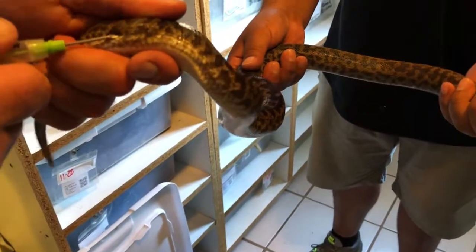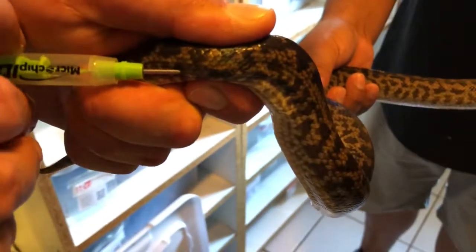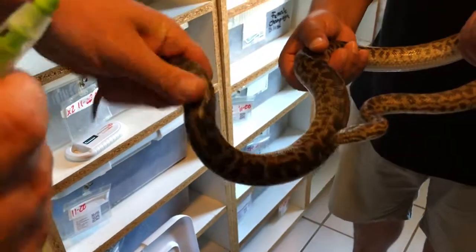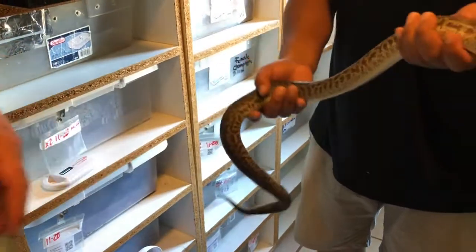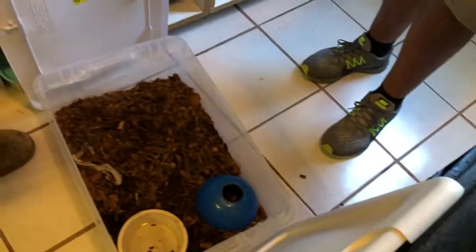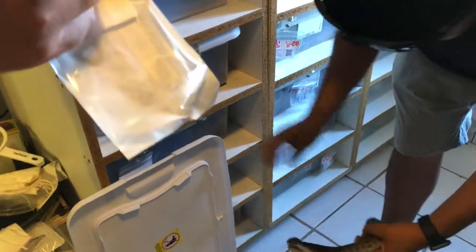Bevel up, underneath the scale, pass through three layers of skin — pop, that's it. Work it in. And that's it — we record 'spider python' and we know which one she is, so now we can keep accurate records.